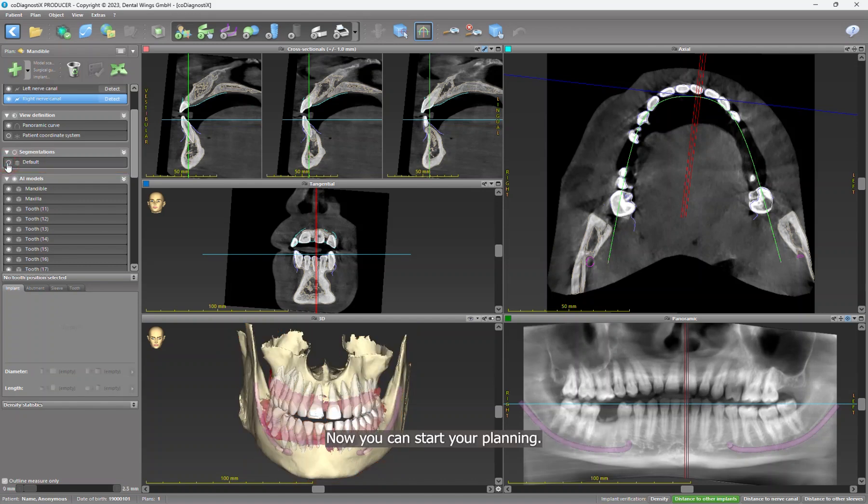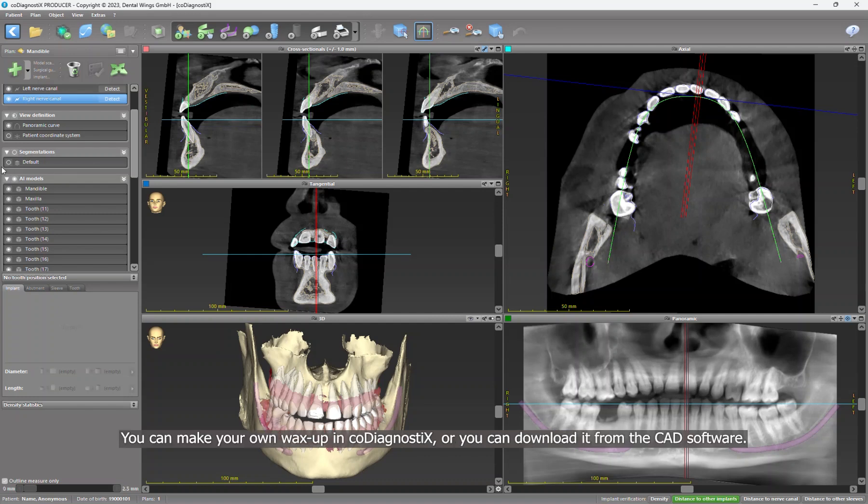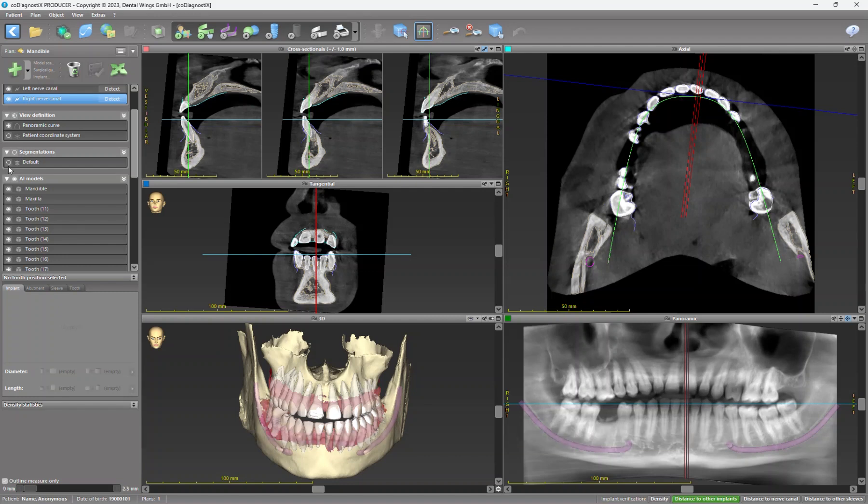Now you can start your planning. You can make your own wax-up in co-diagnostix or you can download it from the CAD software. Let's start with the first option.